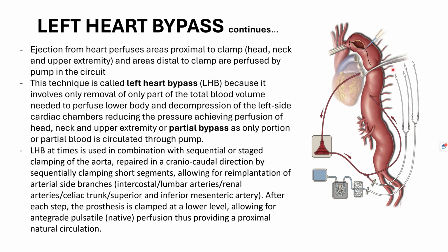And also there will be a lot talked about, like the clamp is placed and clamp is taken off. As they go down, first they will repair a section of it, and then they will take the clamp off, and then they'll move this clamp here, and they'll move this clamp here. So like a lot of clamp off, clamp on, will be there sometimes, depending upon the complexity of the surgery. And we don't really need to worry about all those details. Just take the total clamp time that is mentioned in the pump record, and that's all that we need to know. But the op notes can get confusing, especially these complex aortic surgeries.